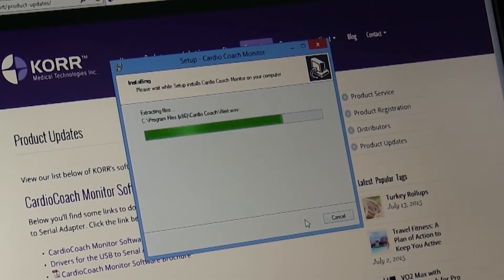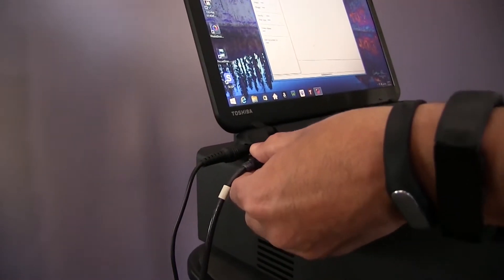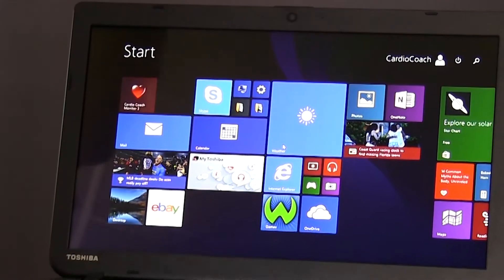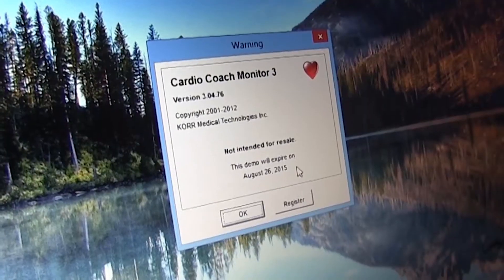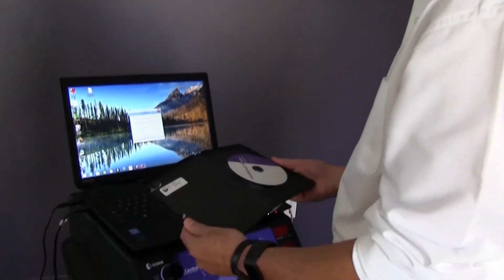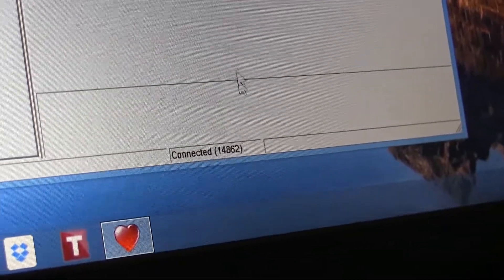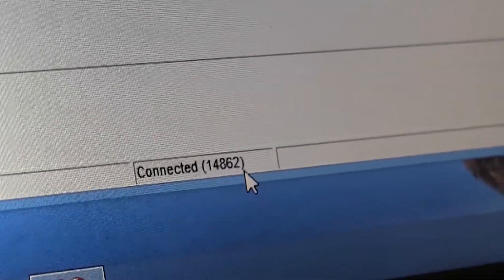After you have installed both the CardioCoach software suite and the USB serial port adapter drivers, reboot your computer and re-insert the USB to serial port adapter. Once all the software is downloaded onto your computer, you will see the CardioCoach software on your desktop represented by a heart icon. Make sure your CardioCoach is connected and powered on before you double-click the icon to open the software. If you have just downloaded the software, you will be prompted to enter the 16-digit registration code found on the DVD included with your purchase. Once the CardioCoach monitor software is opened, you will notice a connection status at the bottom of the window — it should say connected with a five-digit serial number.